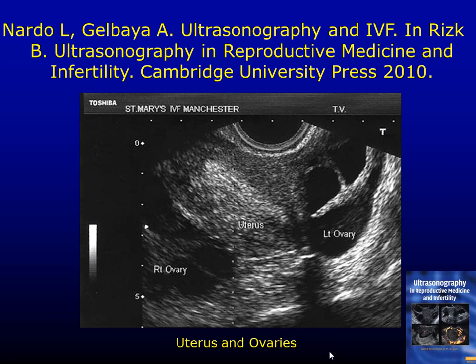Let me show you some during IVF. So during IVF, and I know IVF might not be our common interest, but here is the uterus. The ovary here is behind the uterus. The ovary there is nice accessible. This is the vaginal wall. So you have access here within like 1 centimeter, but this is behind you. So you have to lift the uterus.